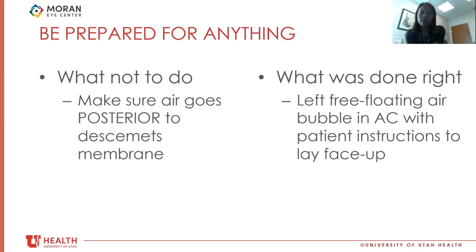So how would you have managed that situation? Yeah, I'm trying to think. I don't think I've had that happen to me, but I really make sure that I am absolutely in the anterior chamber before I inject viscoelastic, because you could easily start injecting as you're in the middle of your paracentesis, and you're more prone to a detachment that way. But if you really make sure you're completely in the AC before injecting, then you can prevent that from happening. Yeah, okay, cool. All right, thanks, that's great.